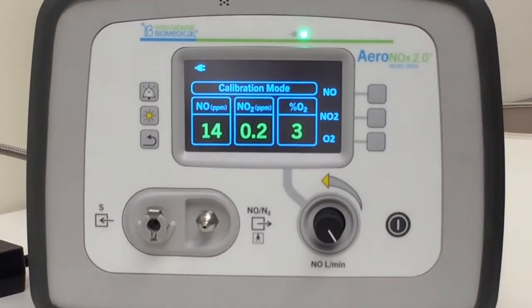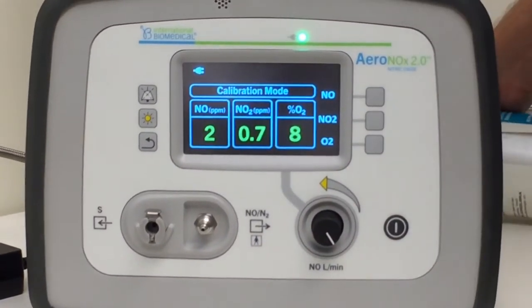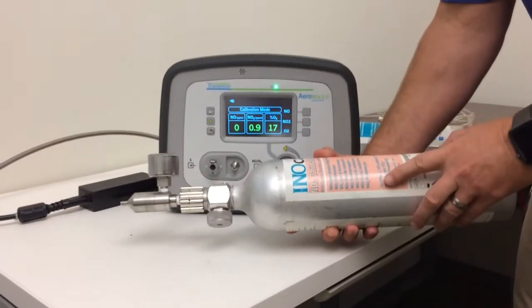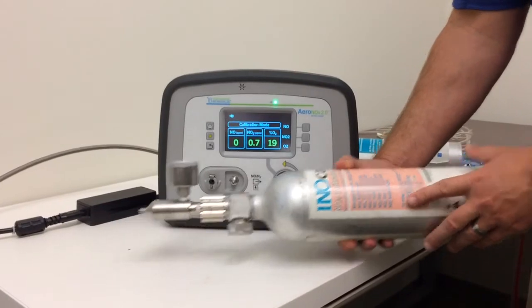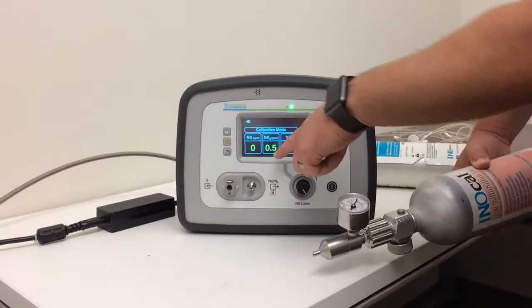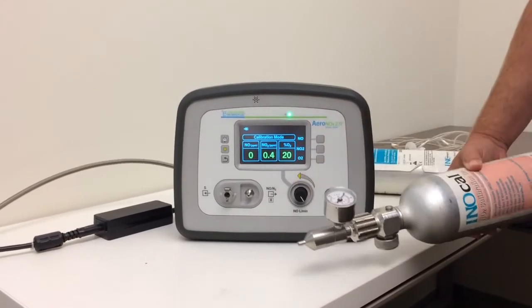We do the exact same thing with the NO2 — it looks like this. It's usually got 10 parts per million. We'll put the same circuit on, hook it to the sample port, run it up to 10, and use the arrow keys to adjust.